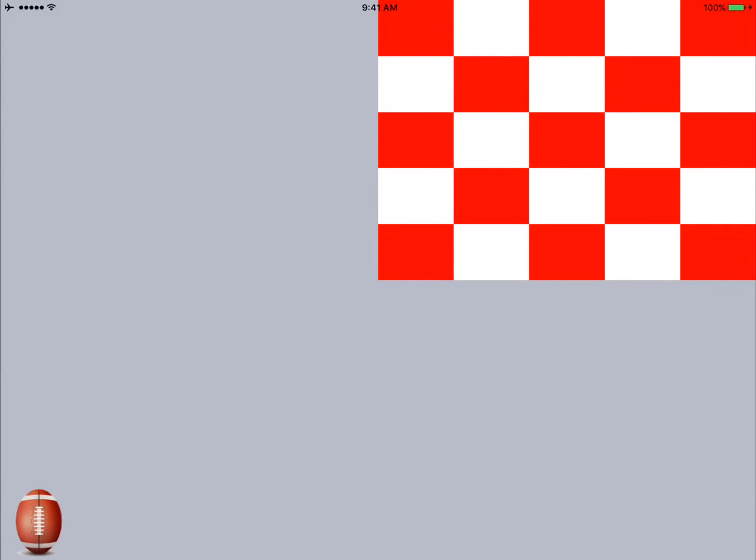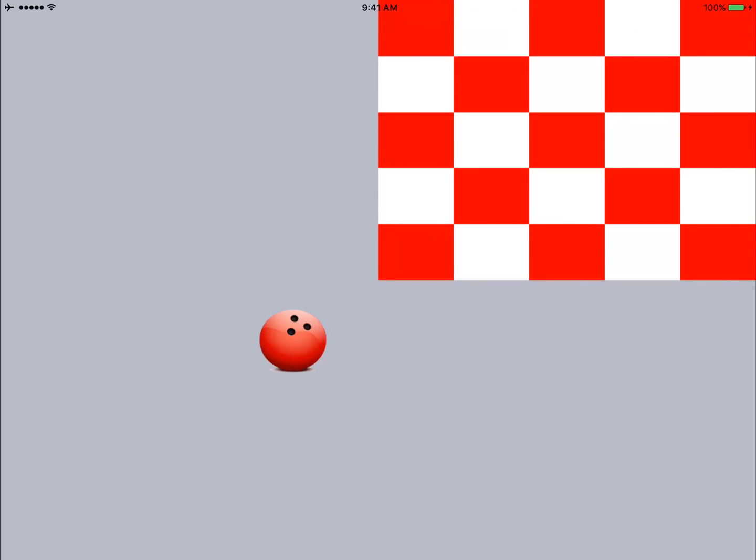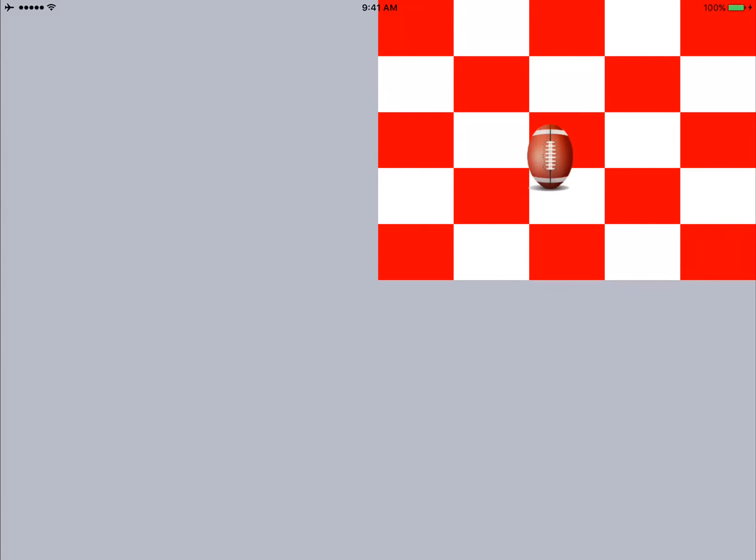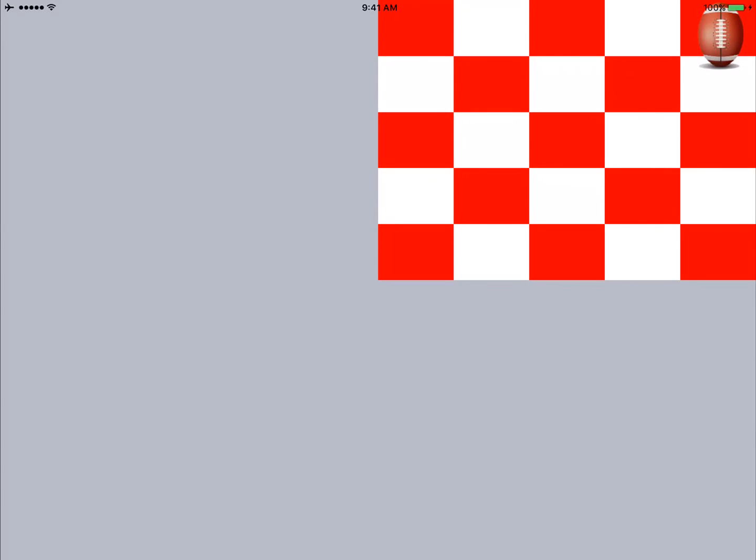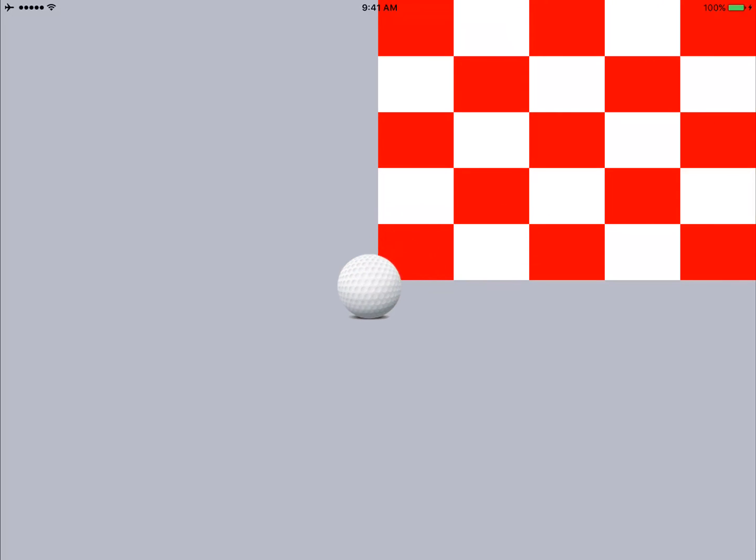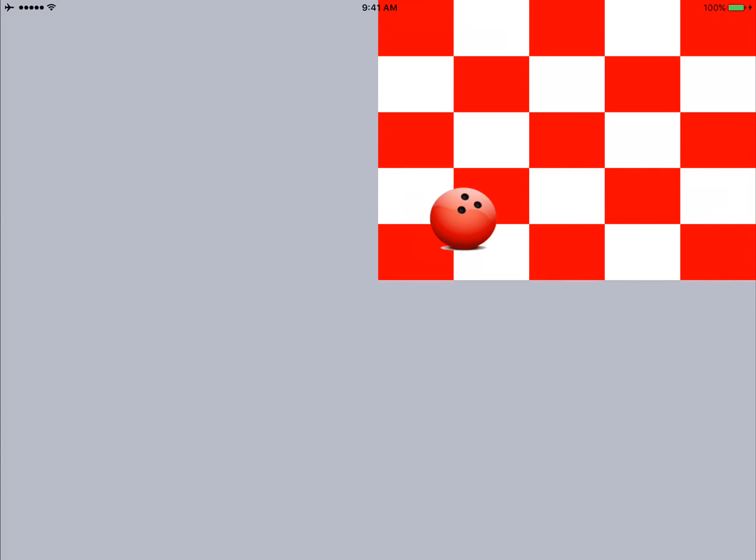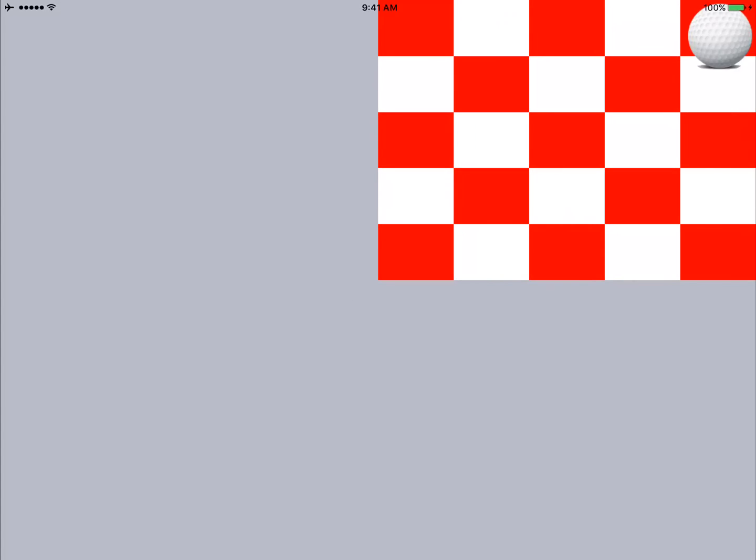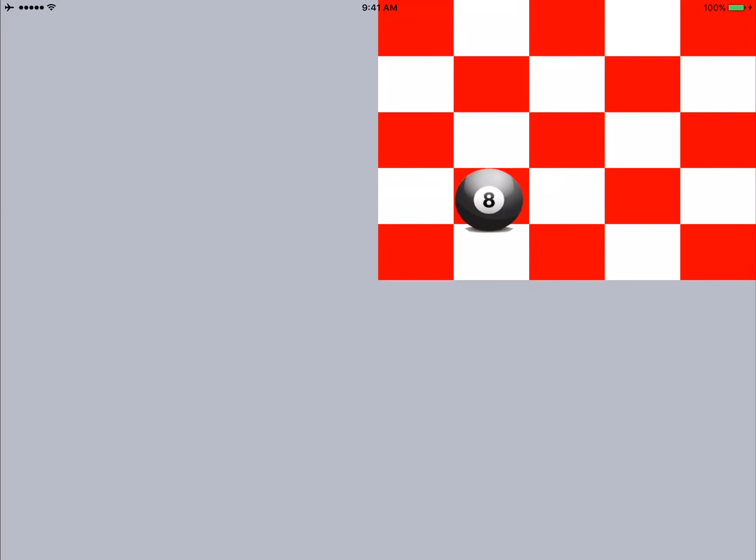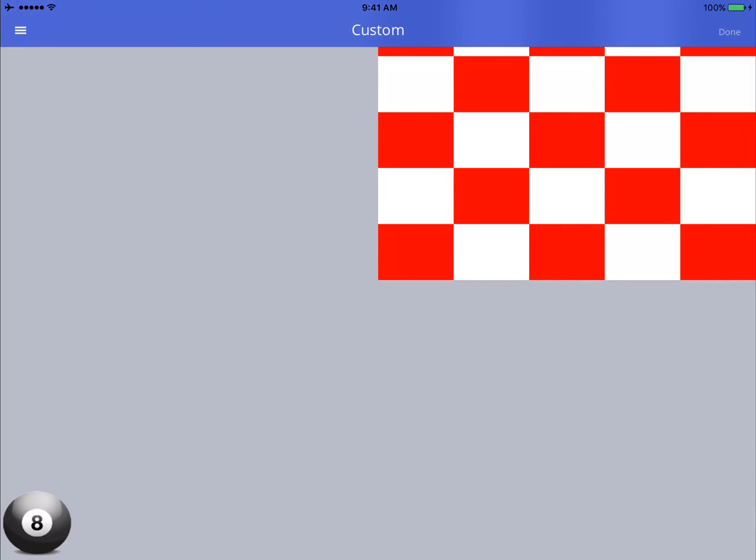So here we go. This is what it looks like. You can see the saccades moving up and to the right. And in this case, we're activating the left hemisphere. Here we've got the hemi-stim going in the upper right field, stimulating the left temporal lobe to optimize word retrieval. This will be really good for his left brain, left frontal lobe, and left parietal lobe, with the pursuit going back down to the left and right cerebellum.